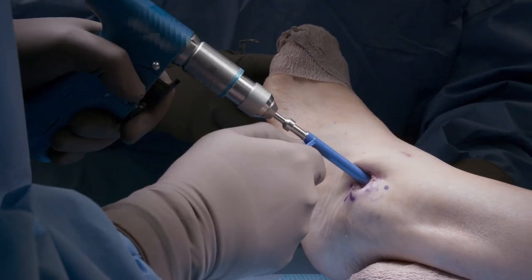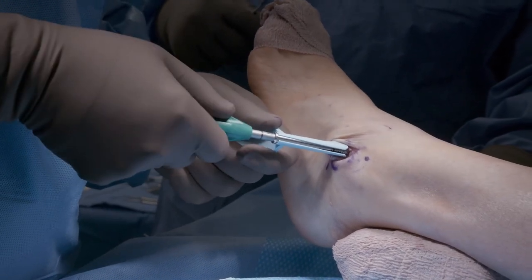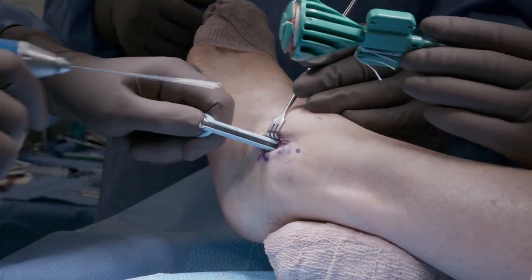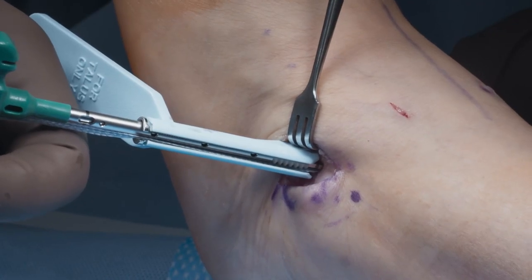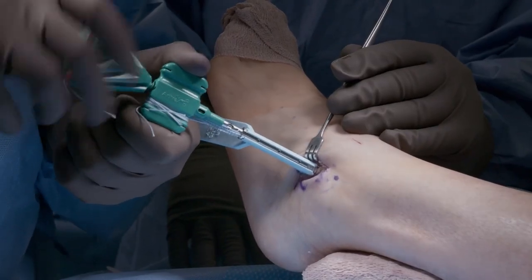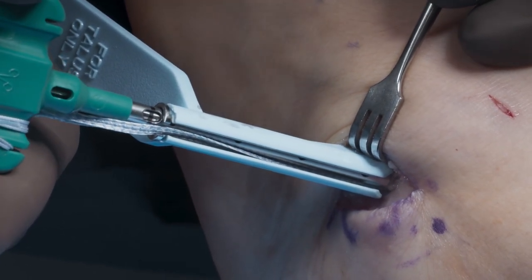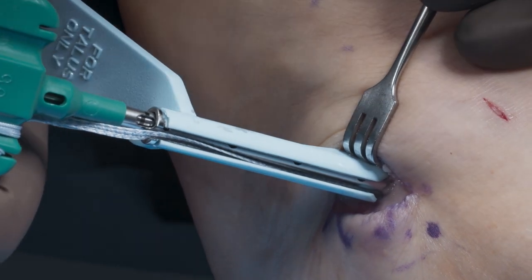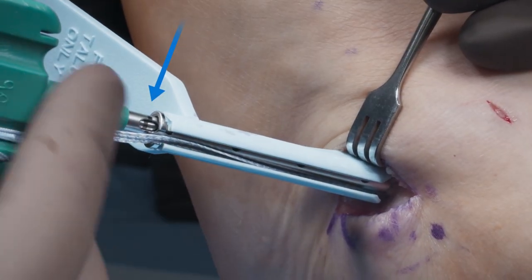Preparation of the talus is performed with a 3.4 mm cannulated drill and a 4.75 mm cannulated tap. Remove the K-wire and then gently mallet the 4.75 mm swivel lock through the guide until the anchor body is on bone, then hold the paddle and turn the driver handle to lock the collagen-coated fiber tape into the talus. When the line in the window of the inserter meets the line on the outside of the inserter, the anchor is 2 mm countersunk in the talus.